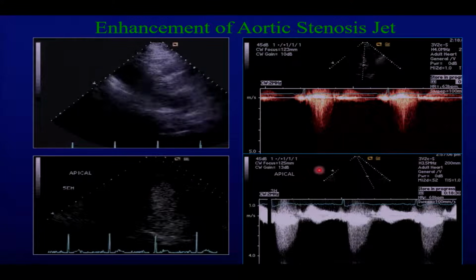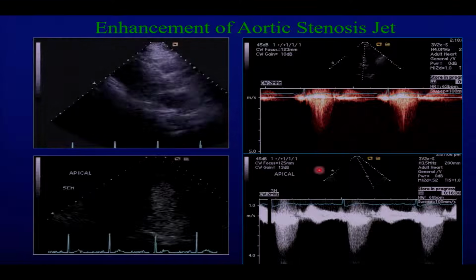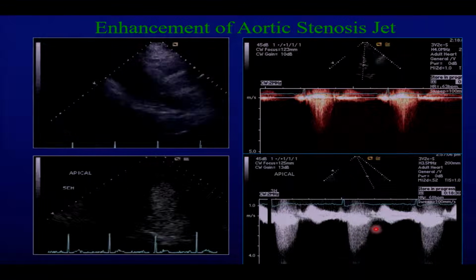So please don't do that just to push an intervention on a patient. You only use contrast when you need it, right? Just like maybe this case where it is not really nicely identified, and here you could see it very nicely. And the ones that you record are after the contrast has almost died down, so you don't see this blooming effect from the contrast per se. Okay?